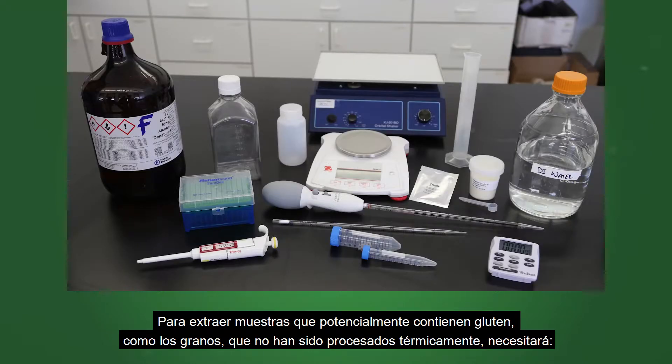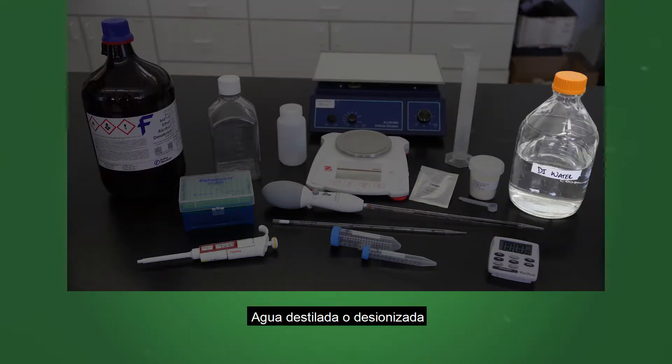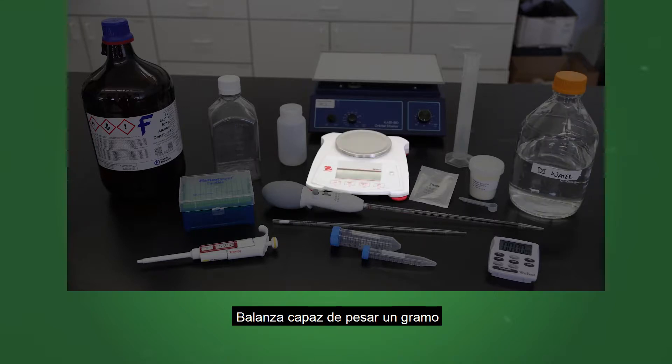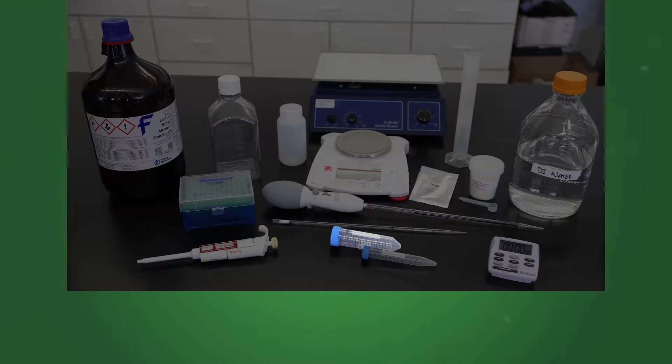To extract samples potentially containing gluten such as grains that have not been heat processed, you will need ethanol, distilled or deionized water, a scale capable of weighing 1 gram, a 50 cc screw cap centrifuge tube, and a 10 milliliter tube.